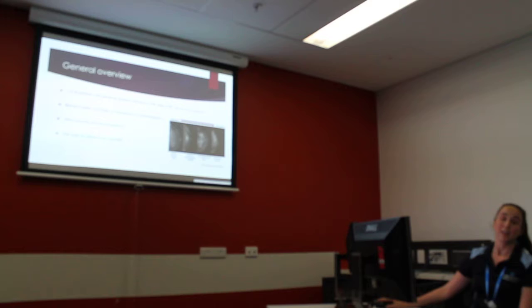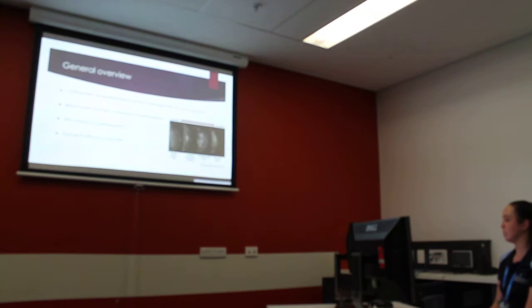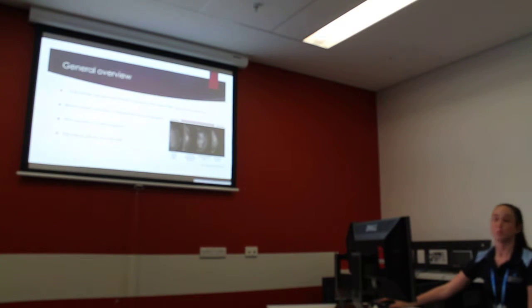It doesn't introduce ionizing radiation either. Gadolinium is generally used, and it's able to change the T1 weighting and enhance the tissue a little further. The disadvantages are high cost, longer scan time, and low spatial resolution.